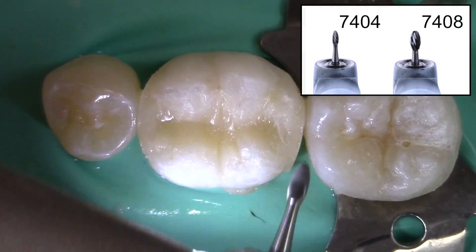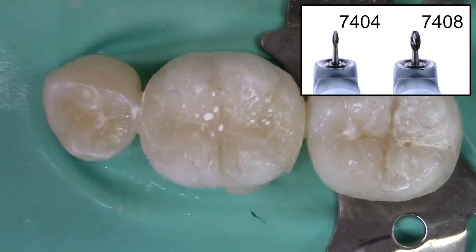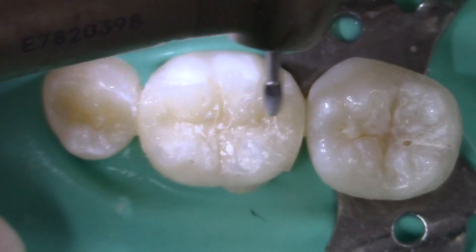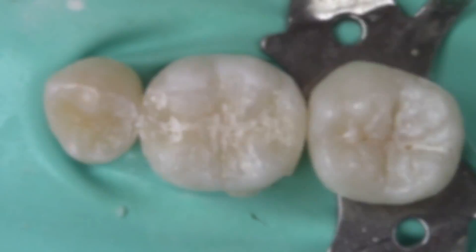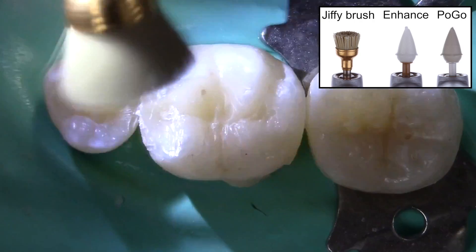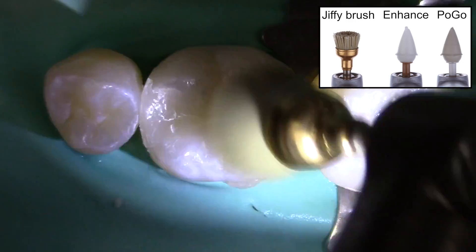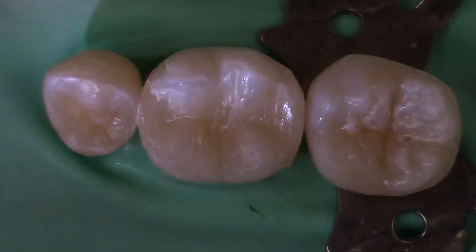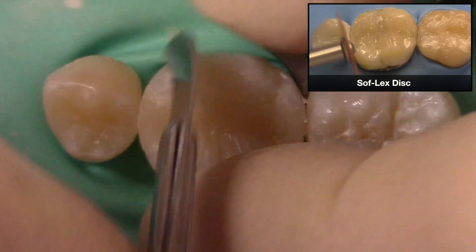The occlusal surface of the restoration is then finished with an egg-shaped red stripe finishing carbide. After adjusting the patient's occlusion, the restoration is polished with a Jiffy brush or an Enhance Pogo finishing point. The interproximal flash can then be removed with a number 15 blade or a Sof-Lex finishing disc.